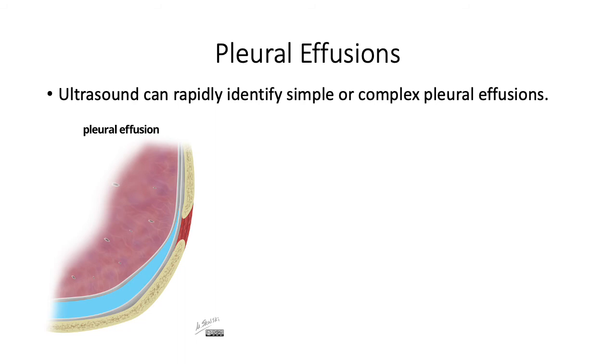The pleural space is more of a potential space. It normally holds a very small amount of lubricating pleural fluid to aid in the movement between the 2 different surfaces during normal respirations. However, in pathology or volume overload, excess fluid will build up between the 2 layers, as shown here in this diagram.